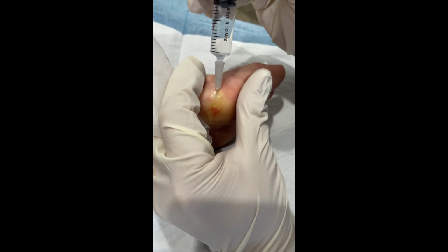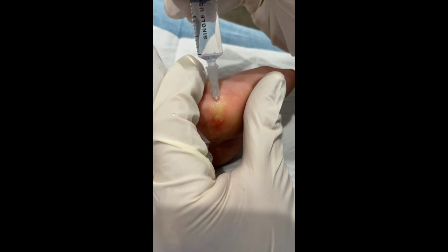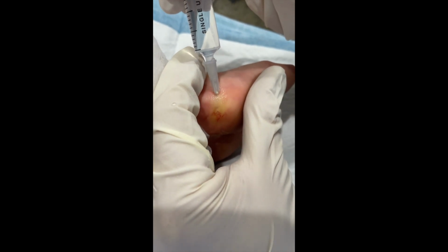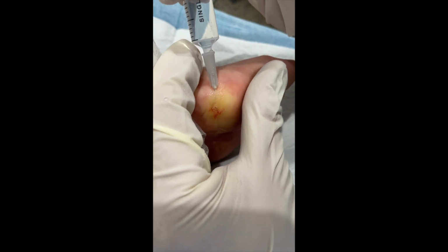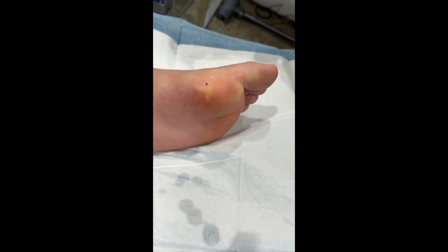As you can see here, we have some blanching of the skin that comes out white, and that just informs us the anesthetic is in the correct area. At this point now, the patient can't feel anything. We go quite slowly to make sure that the anesthetic goes off as best as possible.